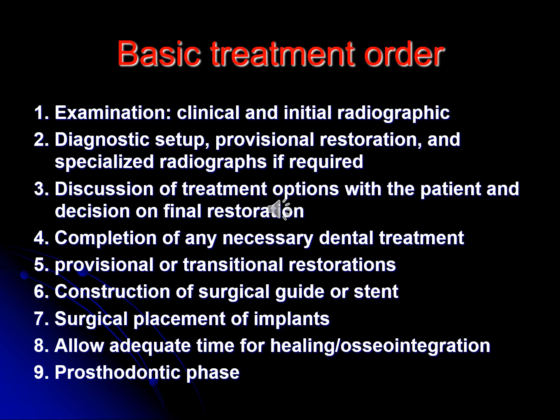Later, we will change this radiographic stent to a surgical stent. This is the same as the radiographic stent, but we will use this stent to help us during the drilling of the implant site.